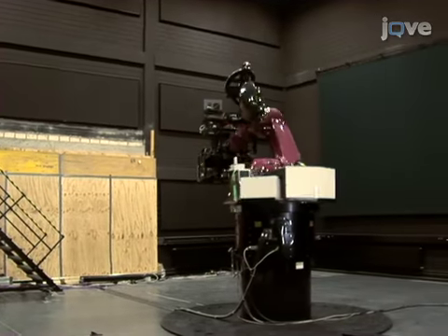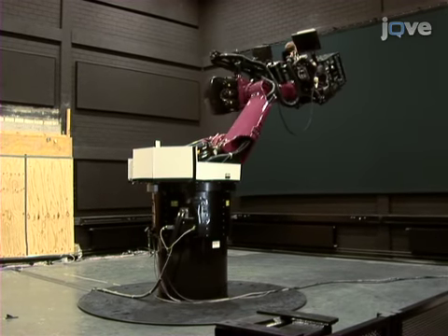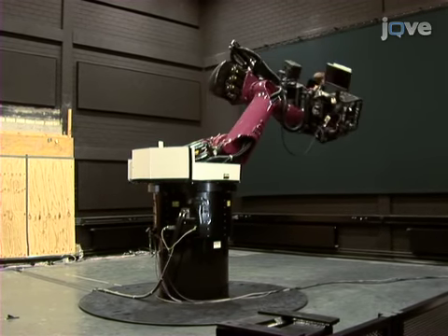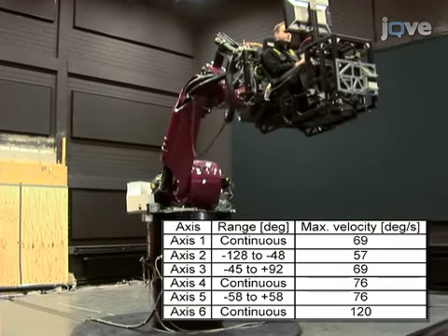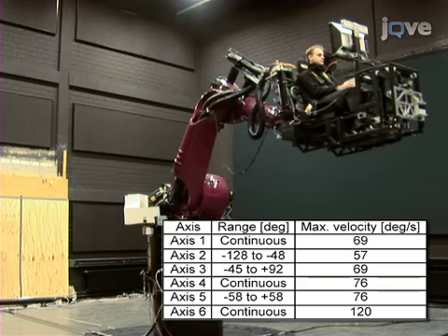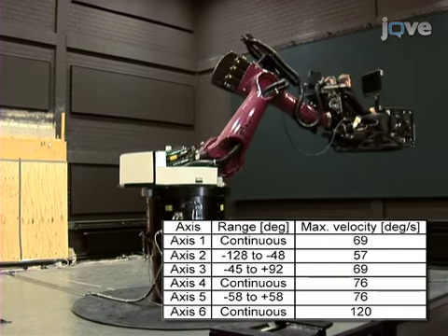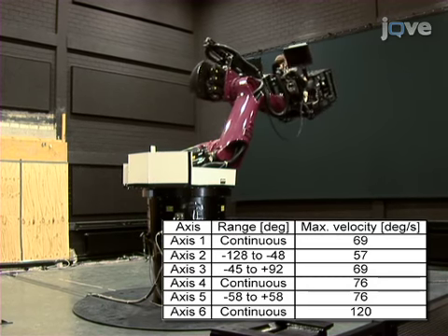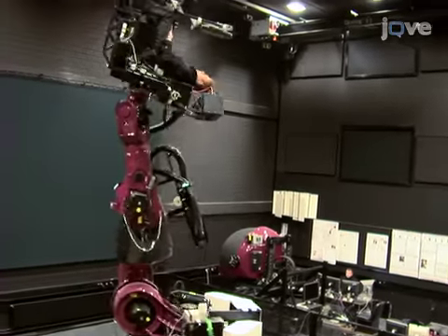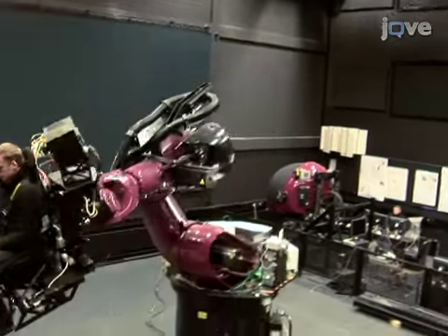Complex motion profiles that combine lateral movements with rotations are possible with the MPI Cyber Motion Simulator. Axes 1, 4, and 6 can rotate continuously. 4 pairs of hardware end stops limit axes 2, 3, and 5 in both directions. The maximum range of linear movements is strongly dependent on the position from which the movement begins. Before performing any experiments, each experimental motion trajectory must undergo a test phase.